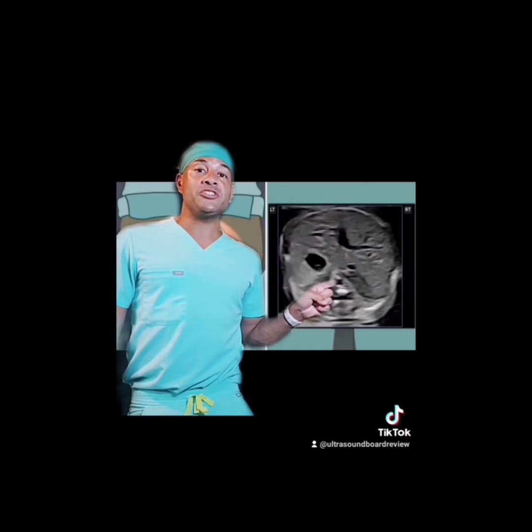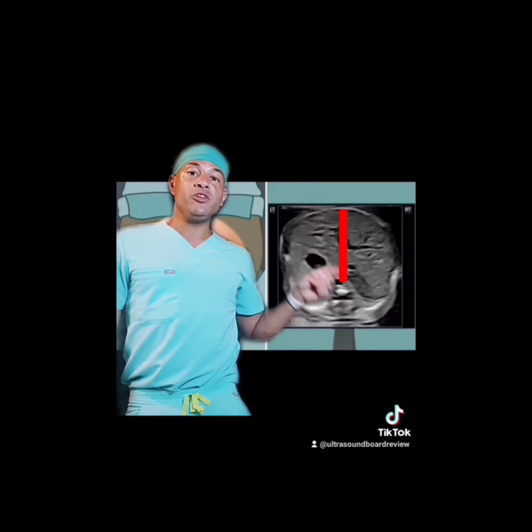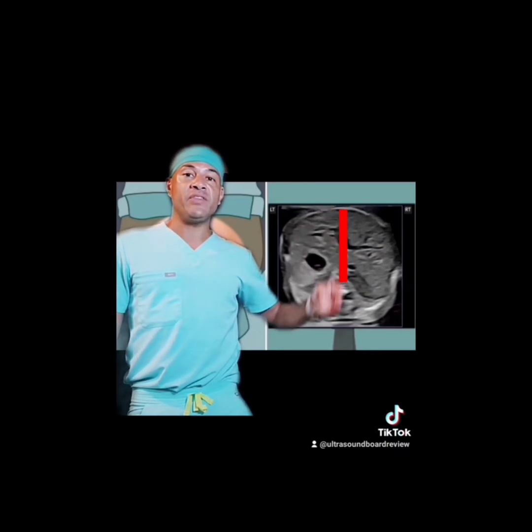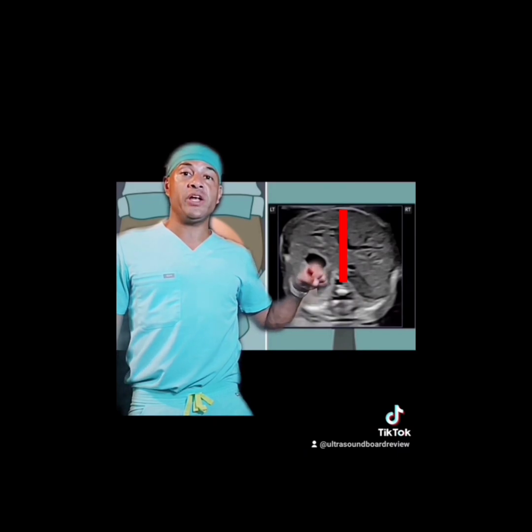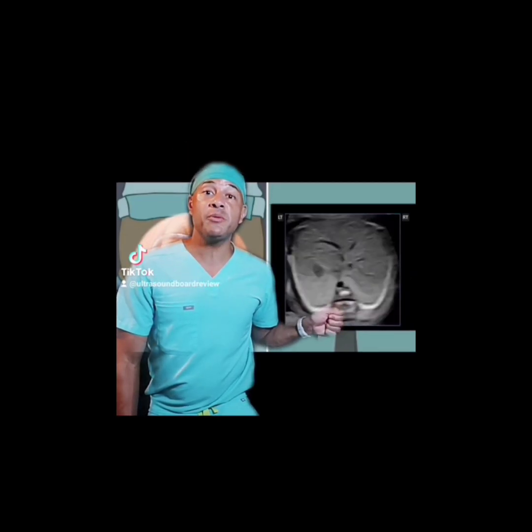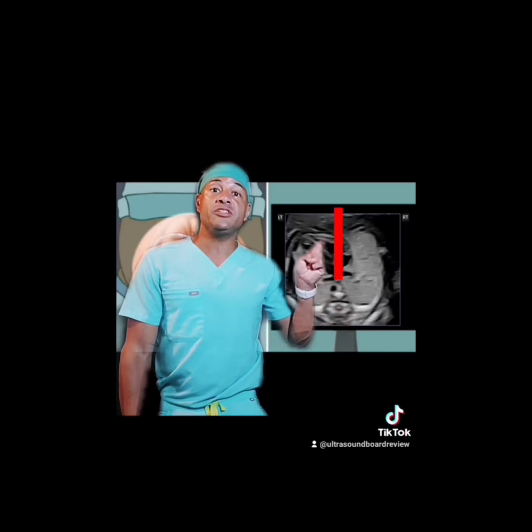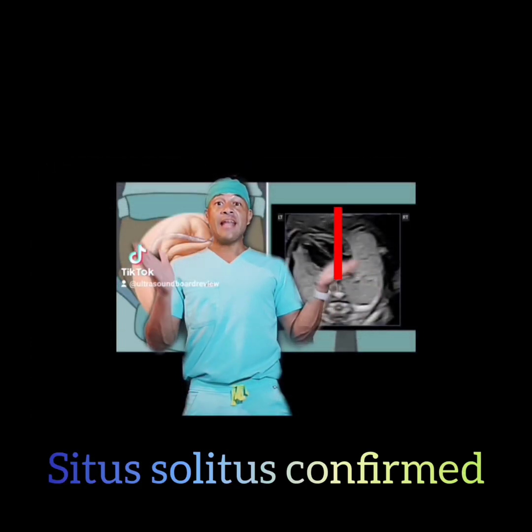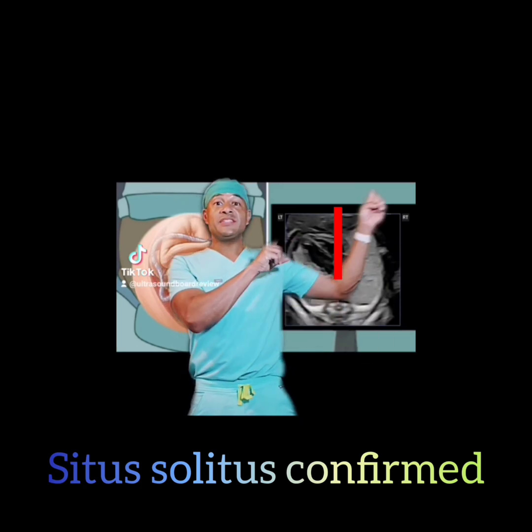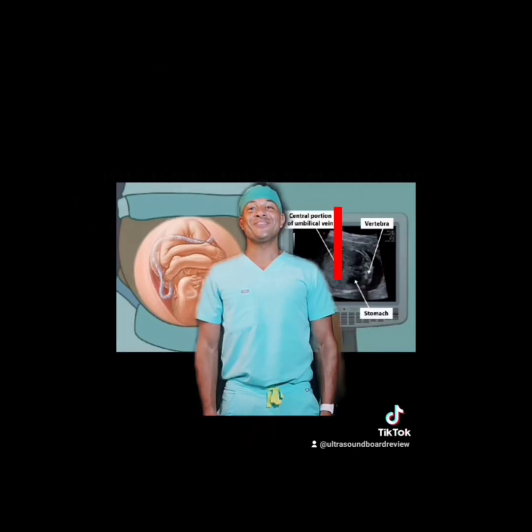Draw an imaginary line from the spine to the anterior wall of the fetal abdomen to decide which side the stomach is on. Then sweep from the abdomen to the heart and draw another imaginary line from the spine to the anterior chest wall. If the apex of the heart is pointing to the same side as the stomach, this confirms your fetal situs. Now we know this is the left side, this is the right side, and this is the cephalic presentation.